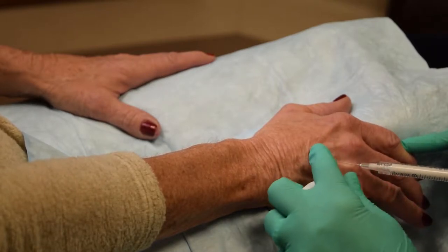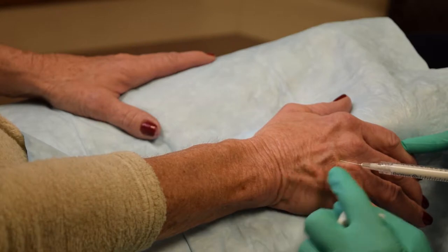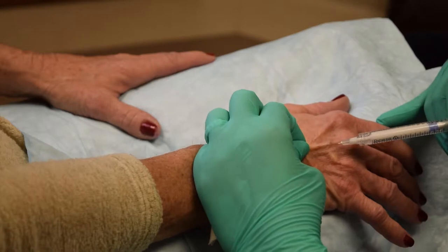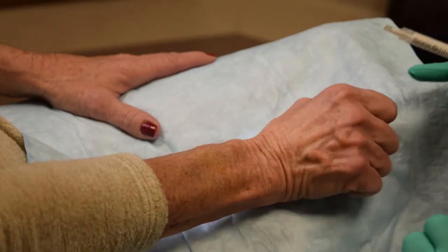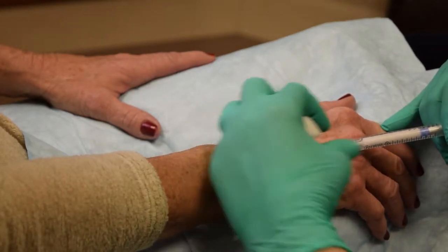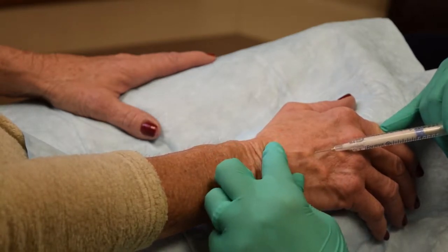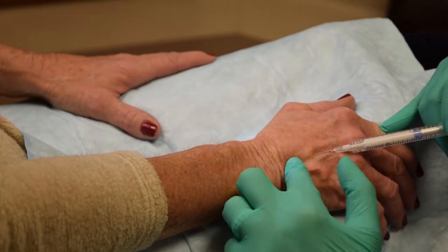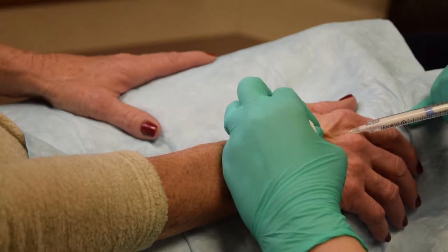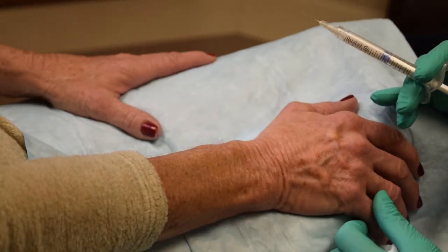Even without lidocaine, injections cause little discomfort. To find my next point of entry, I ask the patient to make a fist, locate the point, tent the skin, and inject slowly. I use my fingers to feel what volume was injected as I also watch my syringe, and I use additional points of entry and injection as necessary.